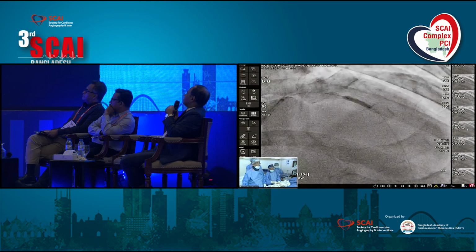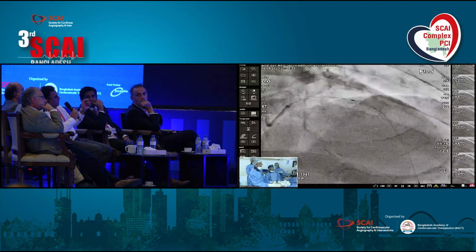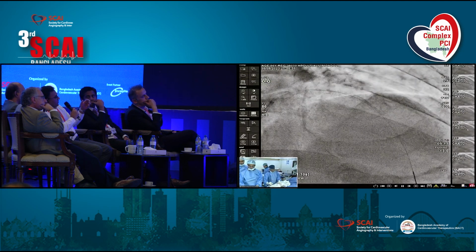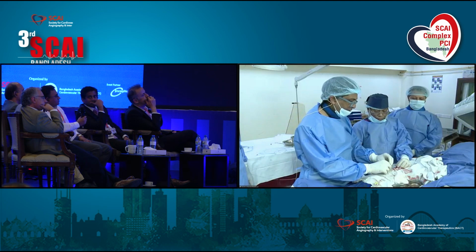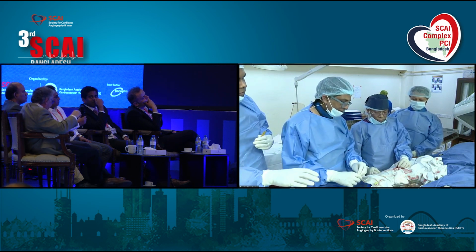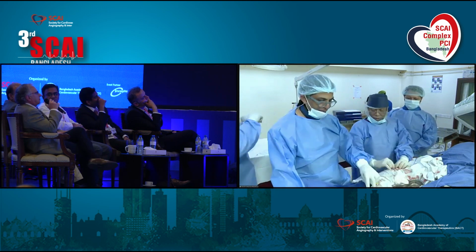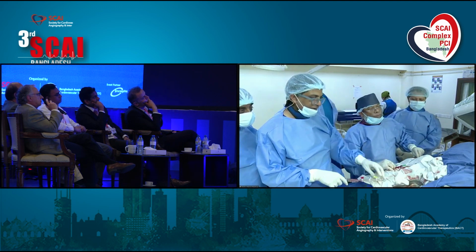Sir, our question for learning of the beginners, should we always remove the side branch wire before post dilatation, or we can keep it? In this case, you have removed already. You can keep it if you want. I think we did the first post dilatation already, keeping the wire in, and then we removed it. Could we have kept it? Yes, absolutely. I don't think that there's anything wrong. It all depends upon how comfortable you are in case that occludes to go back.